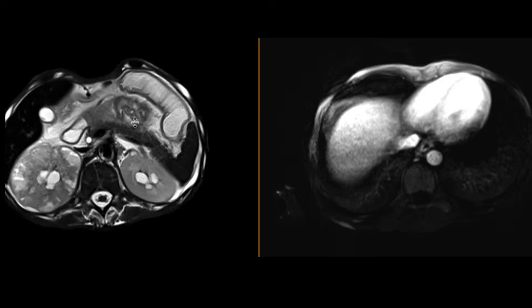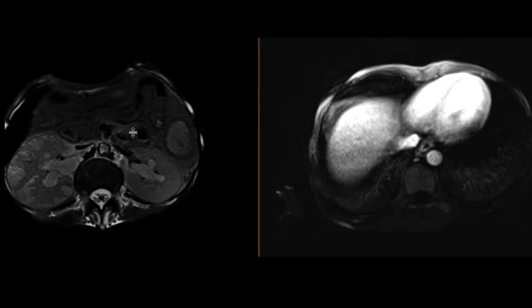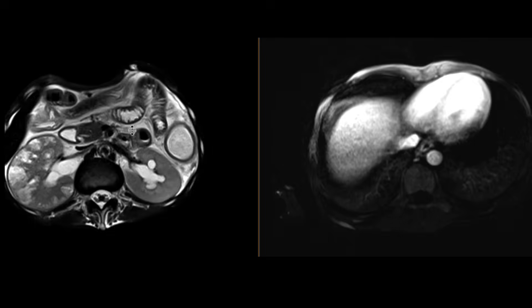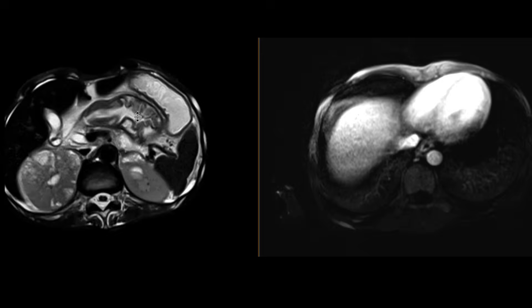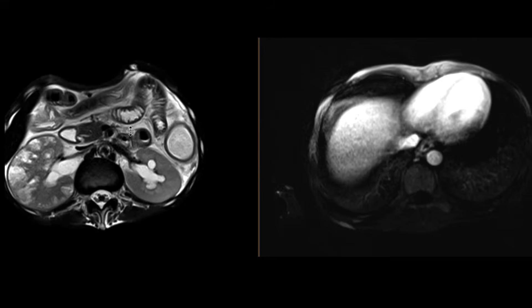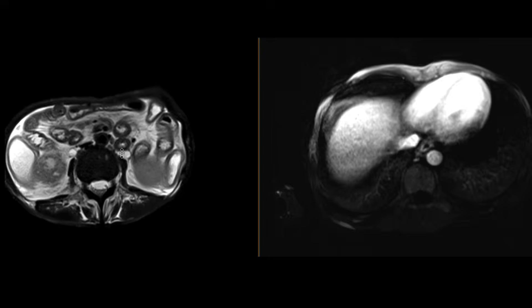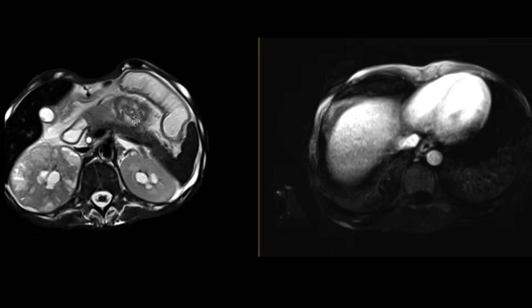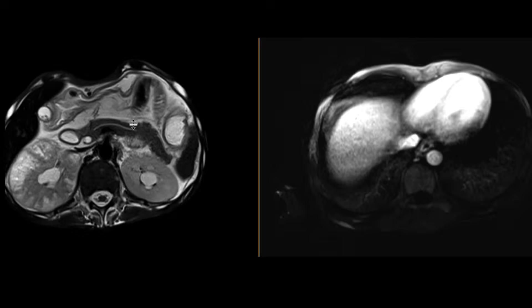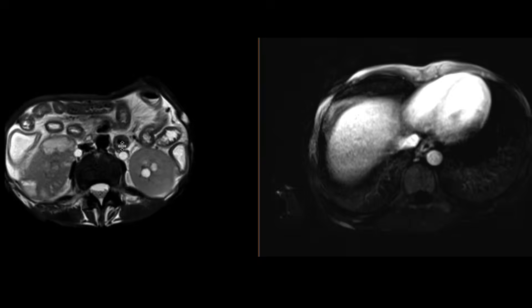As we scroll down, we'll just focus on the kidneys. We can see that both kidneys are quite abnormal — there is certainly hydronephrosis. Focusing on the right kidney, we can see that it is asymmetrically enlarged compared to the left kidney, and within the parenchyma it is markedly abnormal.